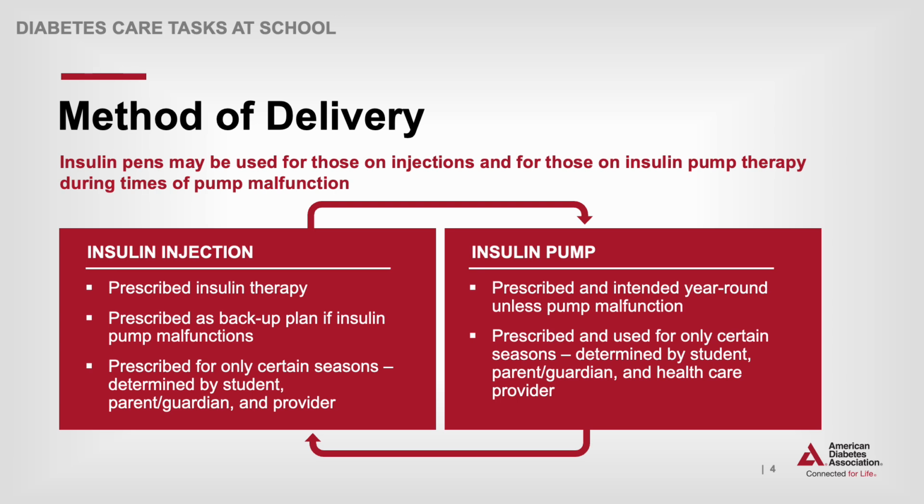It is important to be prepared that students on insulin pumps may still require injections during cases of pump or pump site malfunction. Some students on insulin pump therapy may also return to injections. Please see the student's DMMP for therapy.